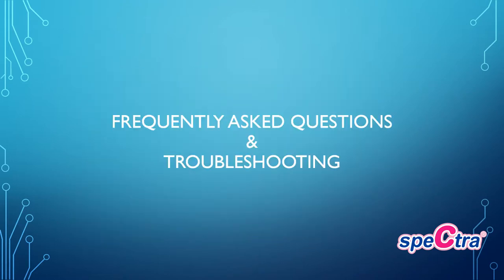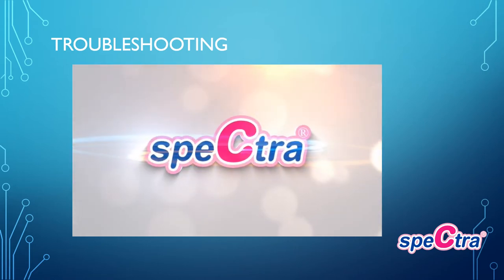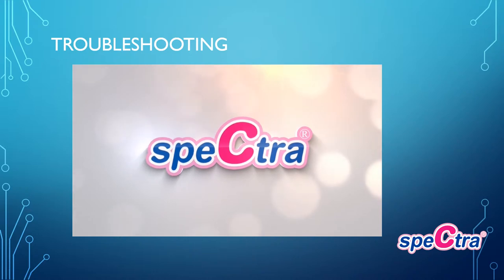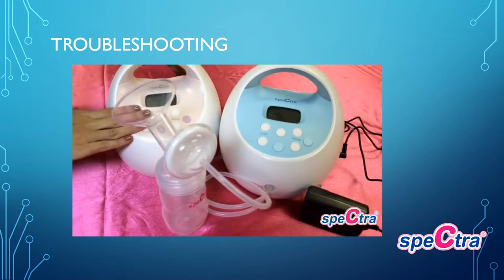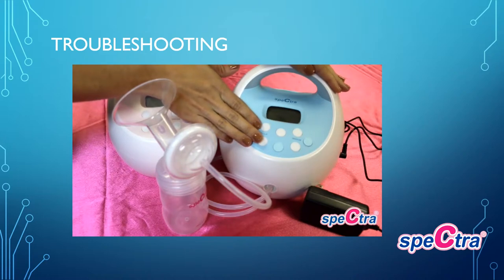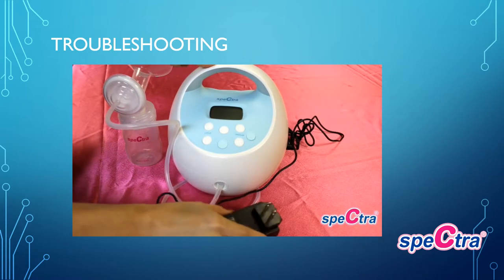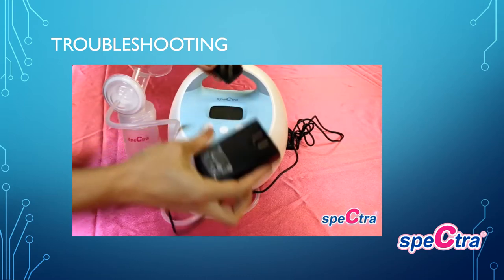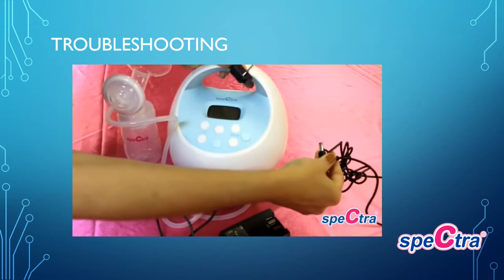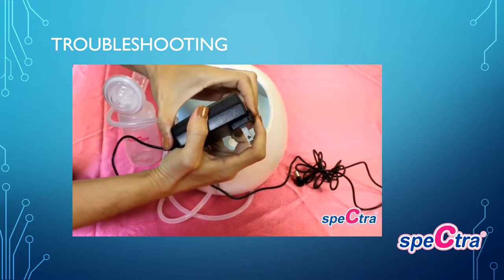Now for frequently asked questions and troubleshooting — the S2 will function the same as the S1 pump; for demonstration purposes I am going to troubleshoot the S1. If your pump is not turning on, the first troubleshooting step is to look at your power adapter. Remove the prong piece from the power adapter and then remove the cord from the pump. Next, push the power adapter all the way down until you hear it click.